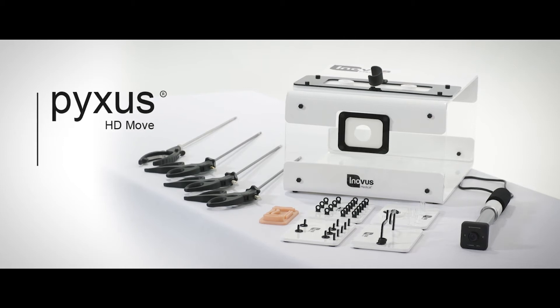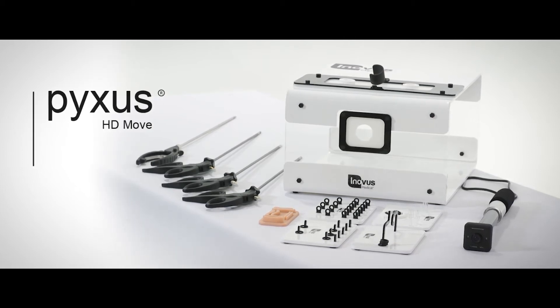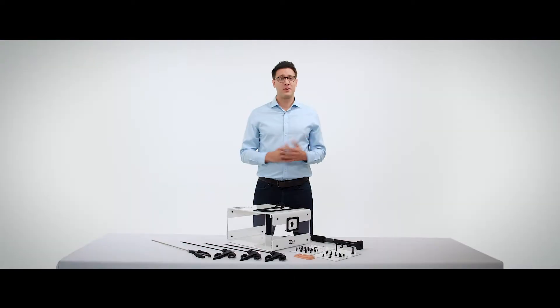This is the pyxus HD Move laparoscopic simulator, our most popular take-home laparoscopic box trainer. There are a number of unique features to the pyxus HD Move laparoscopic simulator. The first is that it is completely flat pack, meaning it is an extremely portable product.